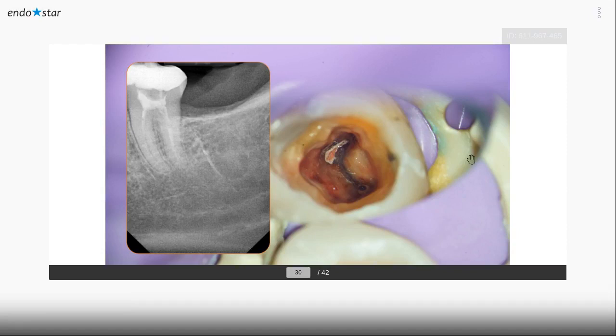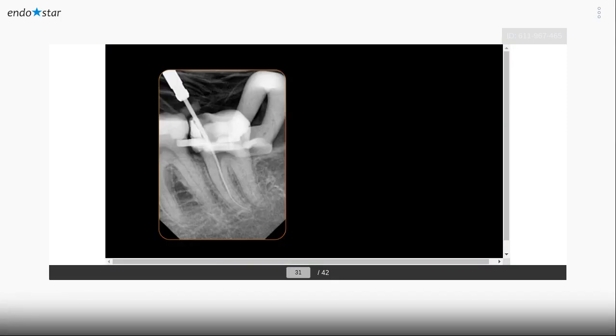Then you will feel that the material is not so tough, not so rigid, and you can use your nickel titanium instruments. Okay, so we removed all the restoration that we had. Then we remove this material, and then let's go.